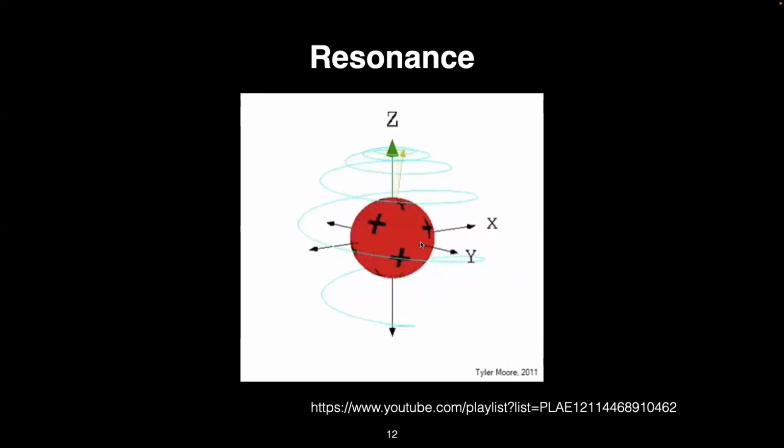All right. And as we have this diagram up here, just want to take this opportunity to establish a basic coordinate system. So for the little bit of math that we're going to talk about, Z in MR parlance typically means the main axis of the magnet.